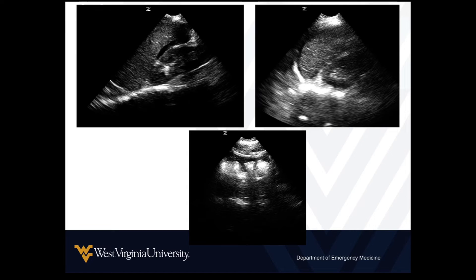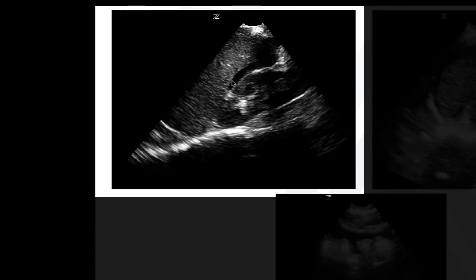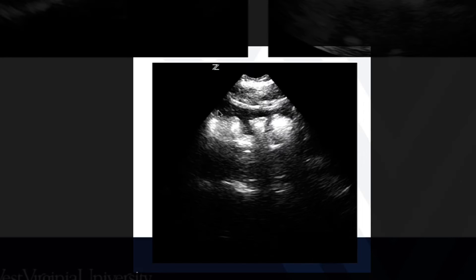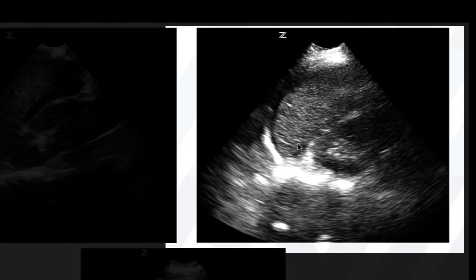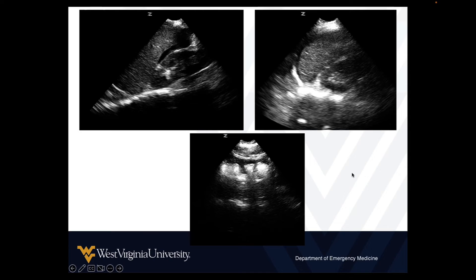Or this could be a ruptured ectopic pregnancy — depending on your scenario, that's where this is going to make sense. Here we see fluid in Morrison's pouch on the right between the liver and the kidney. Here we see fluid outlining the intestines — fluid in the pericolic gutter. And here we see fluid around the spleen. On the left side it's really important to identify the diaphragm, examine the entire spleen, and look for fluid around it if you're looking for intra-abdominal fluid, blood, or spontaneous bleeding.